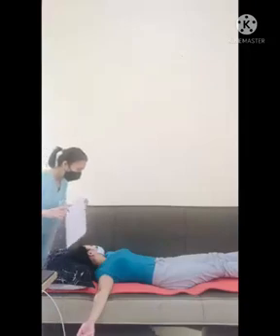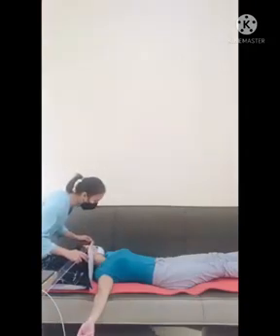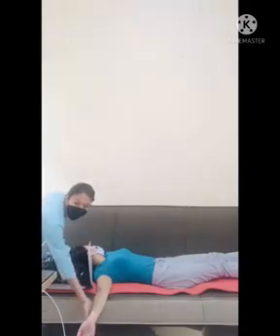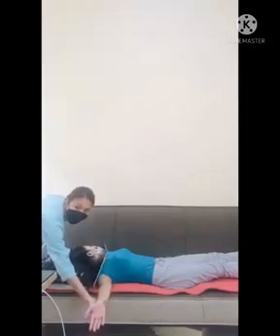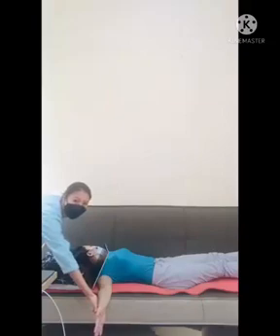We're going to put the image receptor in the same position as in the Lawrence method, but the extended arm is externally rotated until the hand forms a 45-degree oblique, thumb pointed downward.